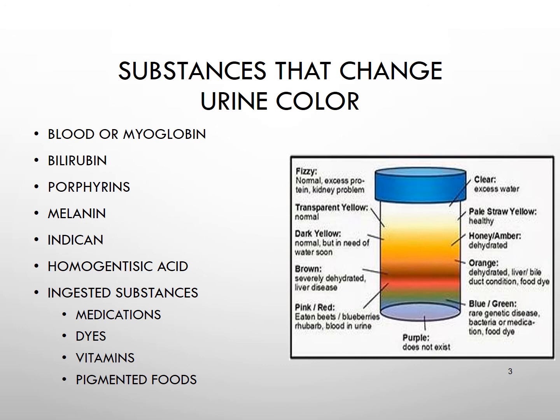So although urine colors can tell us a little bit about what is happening with the patient, let's talk about some of the colors of the abnormal and normal types of urine. An abnormal urine is one that reflects any kind of pathological process. Sometimes it doesn't have an abnormal color, but normally colored urine may contain certain types of pathological elements. So just because yellow is a normal color doesn't mean there isn't anything going on with the patient.